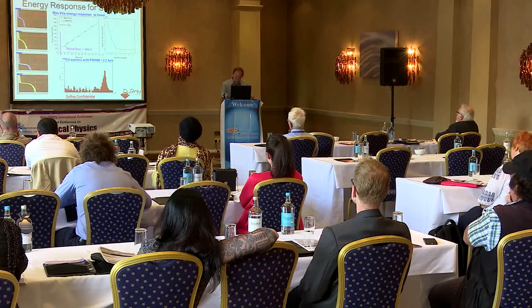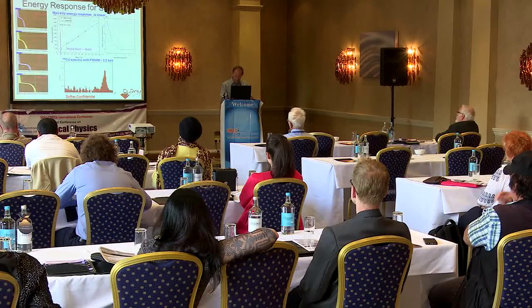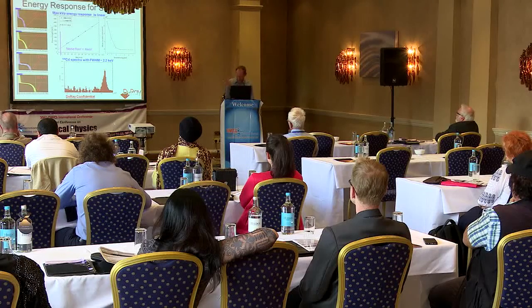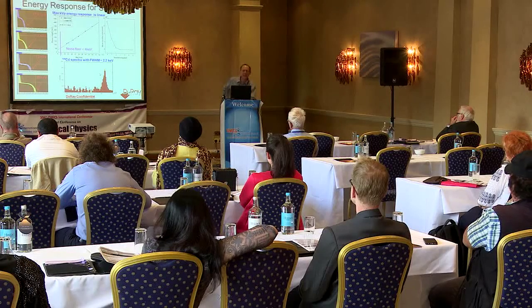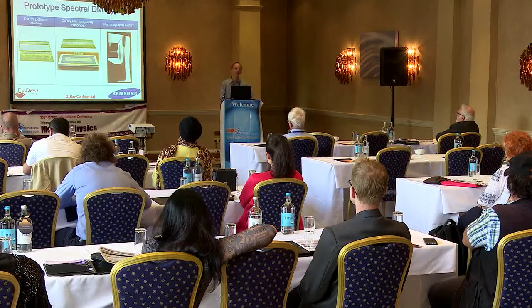Here we can see a noise floor at 4 keV and a linear energy response all the way up to 50 kVp, so that's suitable for mammography. And we see a full width half maximum from a cadmium source at 2.2 keV.